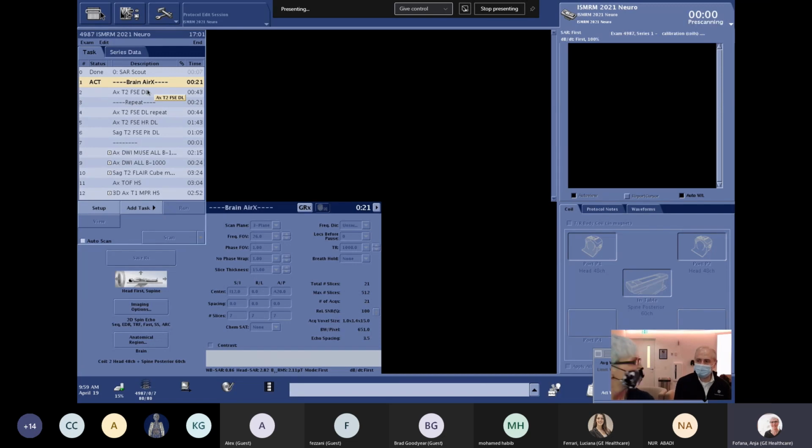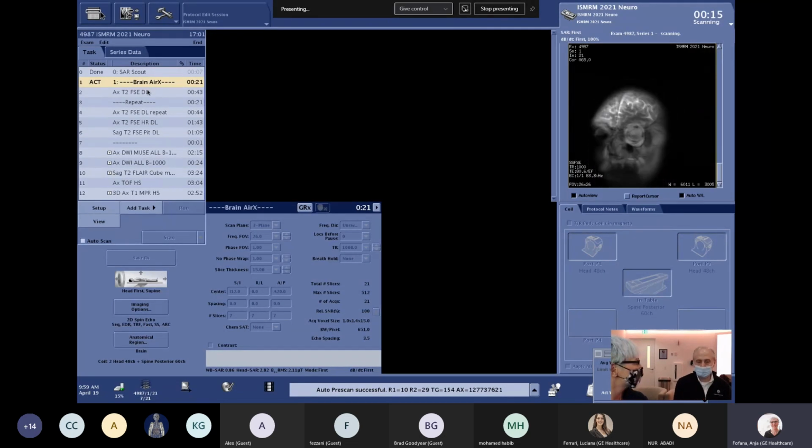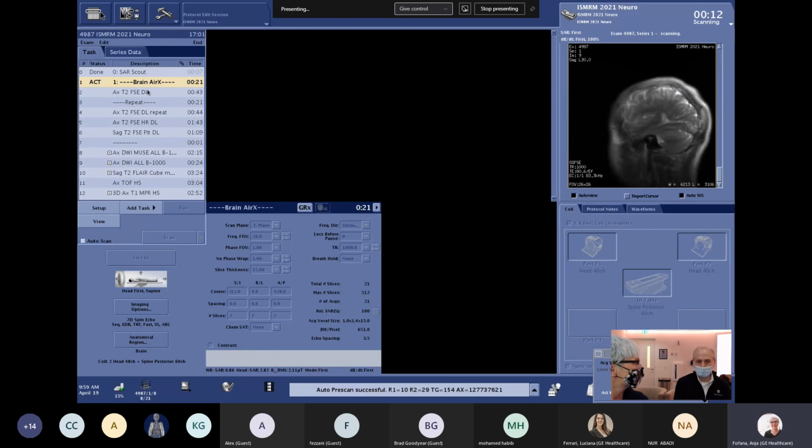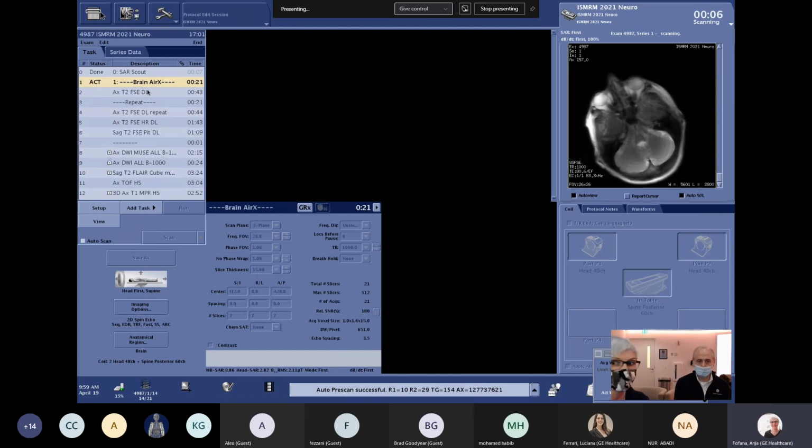So I think in the past, scanning on 3T could pose some significant challenges. They would do a scan that could be really intense with SAR, and then they might have to pause or modify parameters to make it through that acquisition. But by doing it this way, you're able to not have to interleave high SAR, low SAR scans like a gradient echo. You can just continually scan your routine protocols and not be concerned about that.